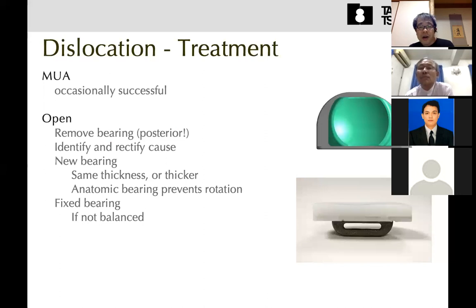So how to treat the dislocation? Sometimes the closed reduction is successful. I experienced 2 or 3 patients where I could reduce the dislocated bearing manually, closed.